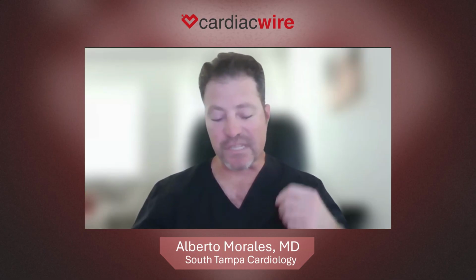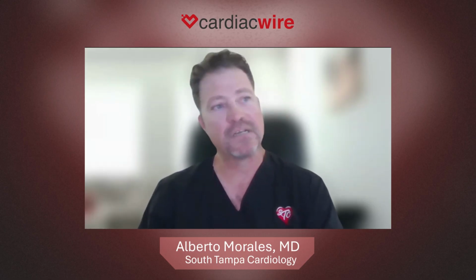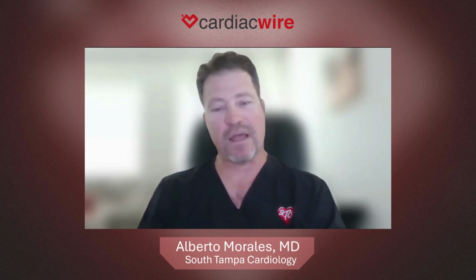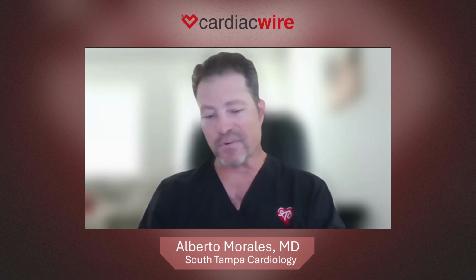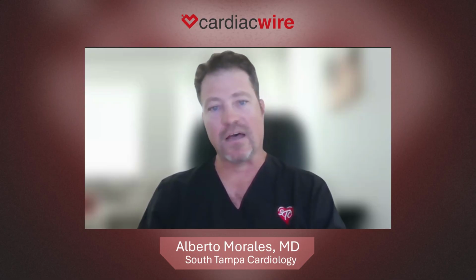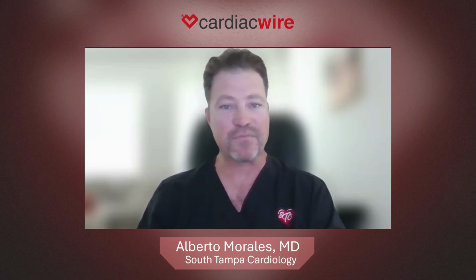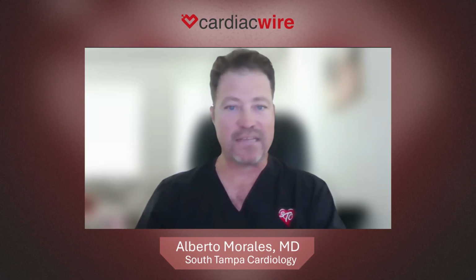With that, I think one of the first things I noticed when I started with this CT scanner was how low the radiation was and how we could extrapolate that and start screening and prevention. And so one of the first things we started doing was screening 50-year-olds. And the thought was these asymptomatic patients, I wouldn't find a lot of disease. And what I found was almost 80% of patients over the age of 50 actually have some form of plaque, whether it's mild stages or advanced stages.